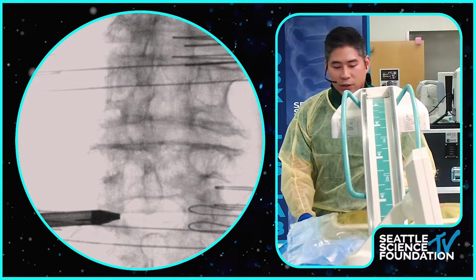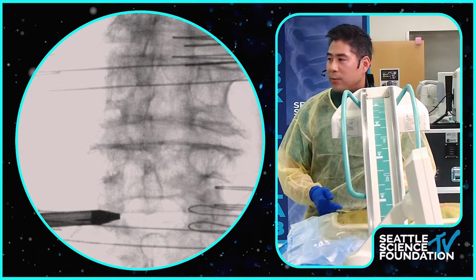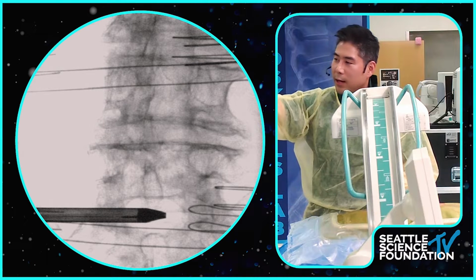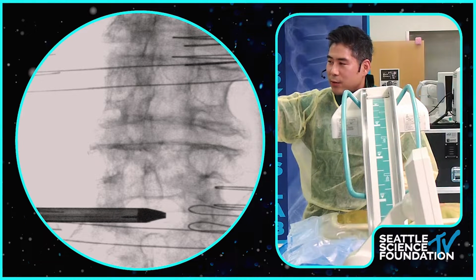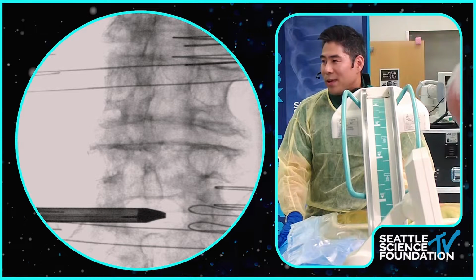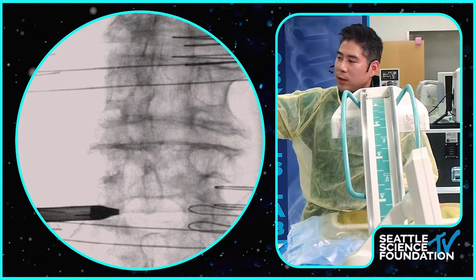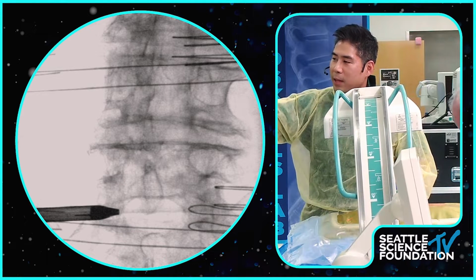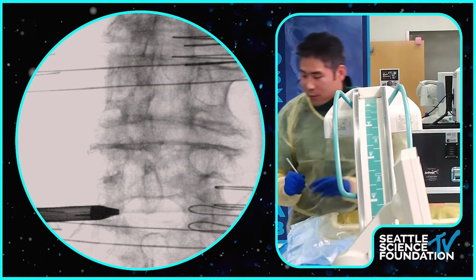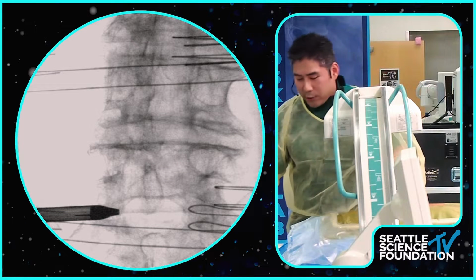If you look at this, this is the spinous process. You can take a shot right here. The spinous process is here. The interlaminar window is that big, a pyramidal and sort of elliptical shape. And then here, take a shot here. This is where I make the incision. It's right at the junction. That's the facet line, and that's where the traversing root is passing through. So I make an incision. I localize there, and I put down the dilators.